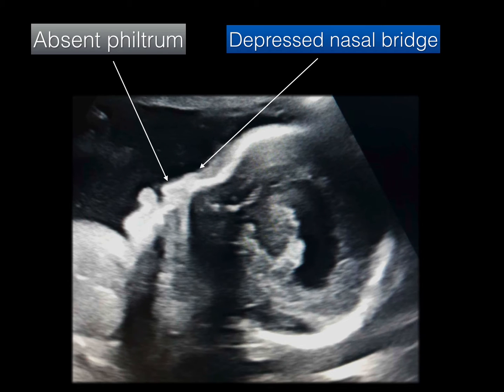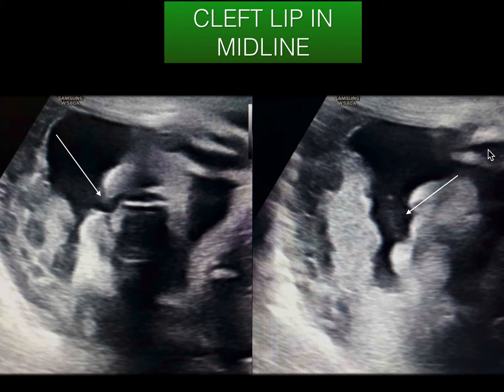A few more findings always associated with holoprosencephaly are facial anomalies. Always look for the nasal bridge, nasal bone, cleft palate, and the lips. Here you can see the lower lip is fine, whereas the upper lip in the midline — this is the mid-sagittal plane — shows a deficiency. The nasal bone is very small and there is a depressed nasal bridge. You can also see a large midline cleft lip due to absent philtrum, visible in the axial plane.